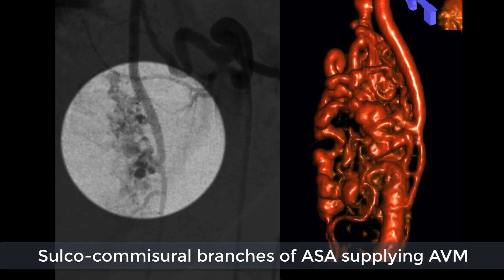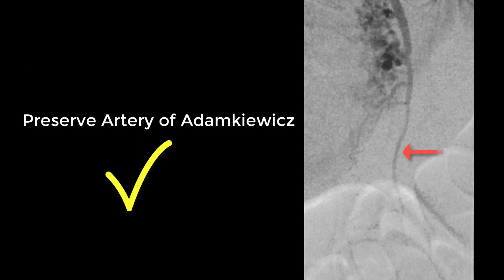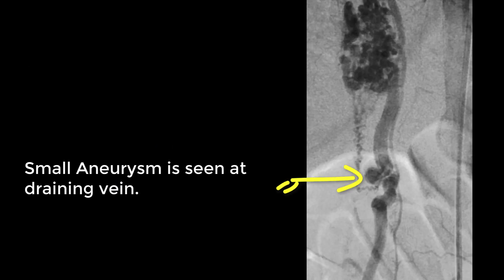Here we could see sulco-commissural branches of the anterior spinal artery supplying the AVM. The artery of Adamkiewicz is supplying normal cord parenchyma distal to the AVM. We must preserve this artery if we plan for any treatment. One could also see a small aneurysm at the draining vein, which could increase the risk of bleeding in the future.